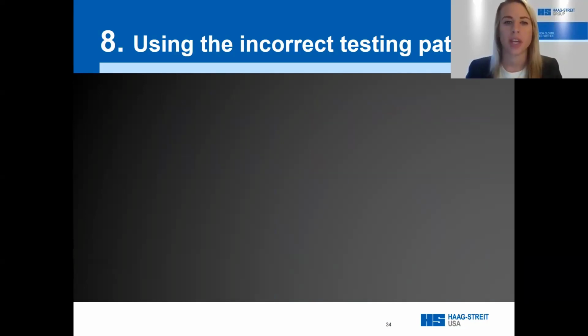If the method of testing is the how, we're going to call number 8 the where. Next on the list is testing the correct location for a specific disease. The goal with picking the correct test pattern is to maximize the parametric information you obtain while minimizing the test duration. We do this by choosing the pattern with high density of test locations in the area of high interest, low density of test locations in areas of low interest.